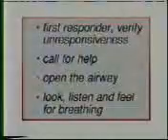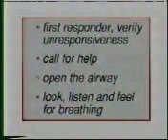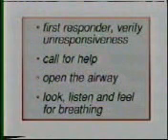The survival of a patient in cardiac arrest due to ventricular fibrillation may depend on how swiftly and competently you put into use the information presented in this video. You must clearly understand and remember the action sequences described here to achieve successful resuscitation of a patient in ventricular tachycardia or fibrillation. Remember, first responder, verify unresponsiveness, call for help, open the airway, look, listen, and feel for breathing.